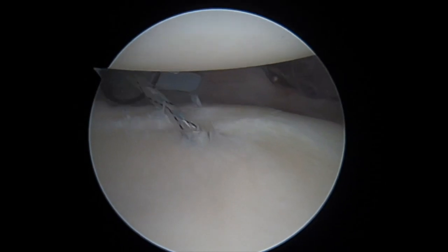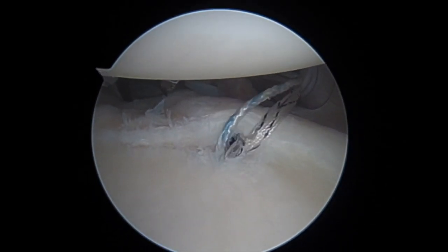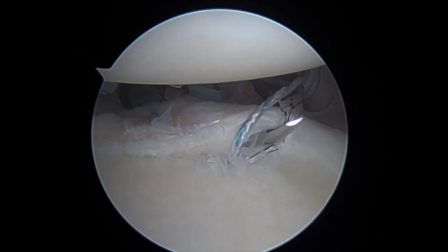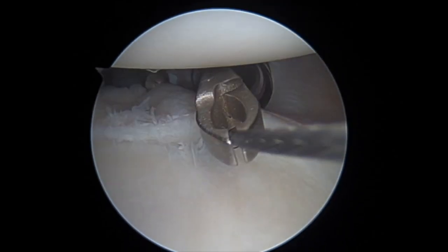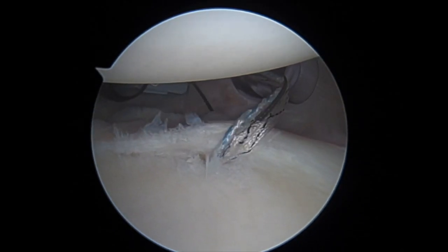The view is switched to an anterior viewing position to view posteriorly, showing both the standard posterior lateral portal and the accessory posterior lateral portal. An anchor can then be placed through either portal at the arthroscopist's discretion and sutures shuttled appropriately.